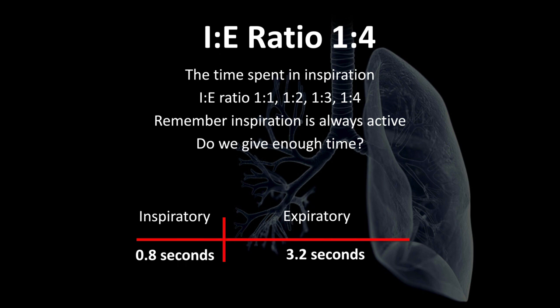So right now we have a patient that has very low ability to generate enough tidal volume, right? We only are giving a small window for them to inhale. They're using the Hamilton. They're using a pressure breath.